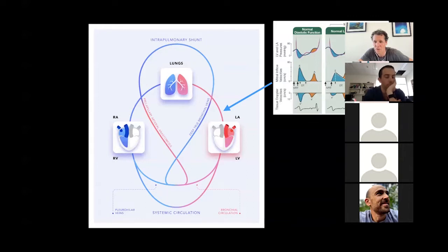Yeah, nice. All right, so Vishal, we've talked there about the E to A ratio. We've talked about the E prime. We've talked about the E to E prime ratio. We've talked about tricuspid regurg, and we talked about left atrial pressure there. So just run through for me again, what would give you a normal left atrial pressure with all of those 5 measures? And then Sid, you're going to tell me what's wrong with all of those measures. So just run through those again.